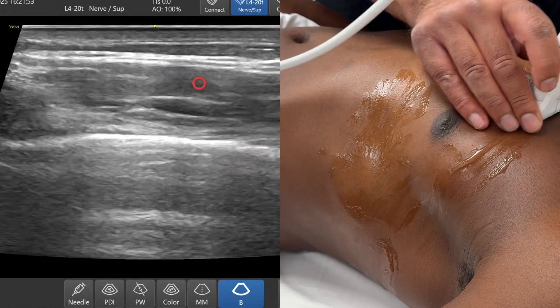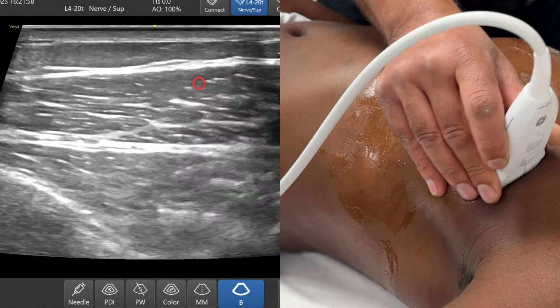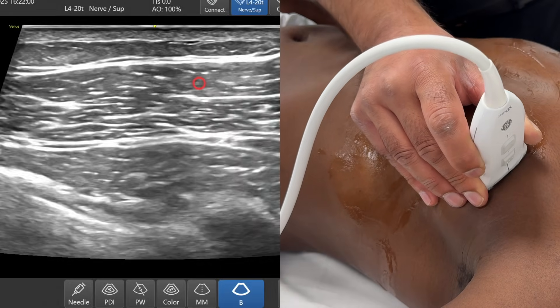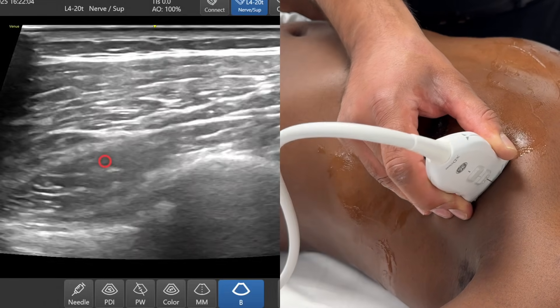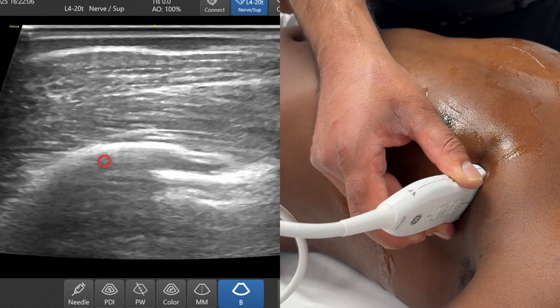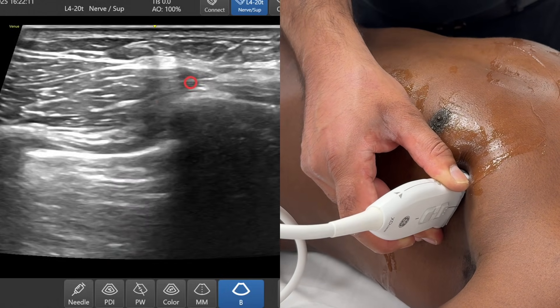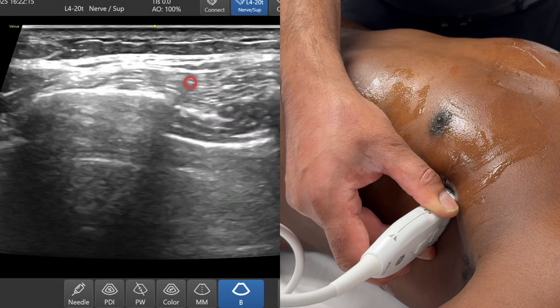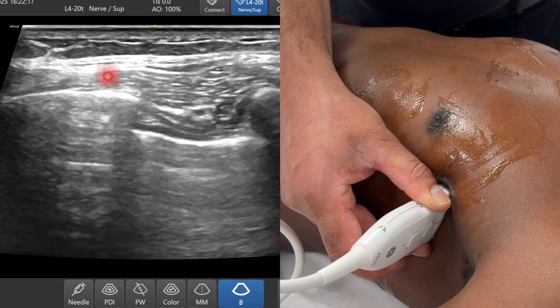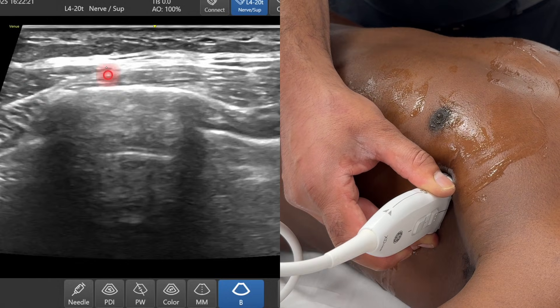Coming back again, up over the top part of the chest — adipose at the top, pec major, pec minor. I'm going to keep scanning laterally. As I scan laterally, pec major ends, then here's pec minor ending right over here, and I'm straight over onto serratus. So the superficial serratus anterior plane block up here is continuous with the pectoserratus plane.